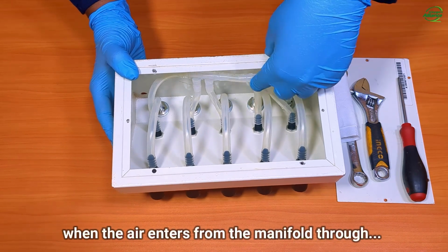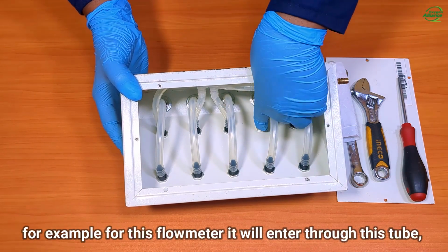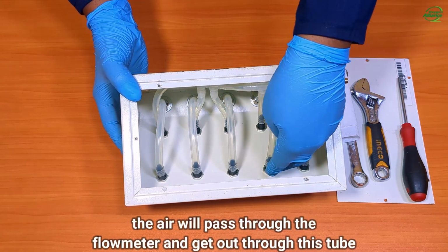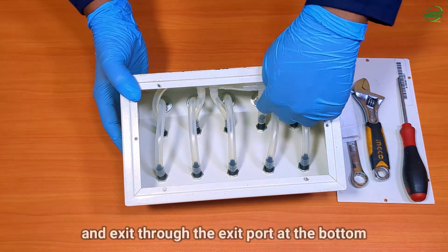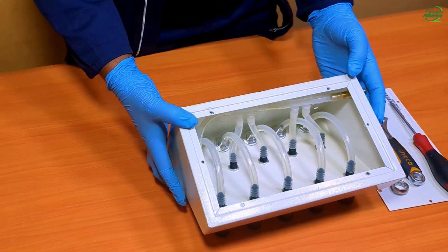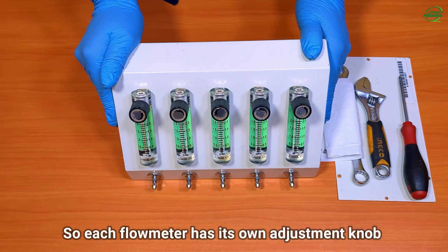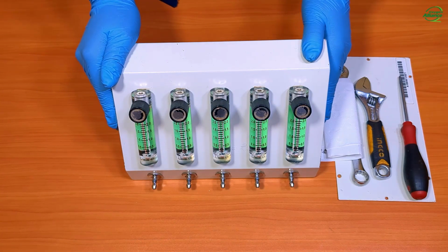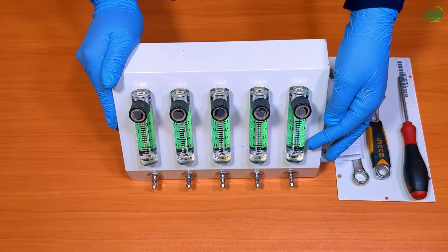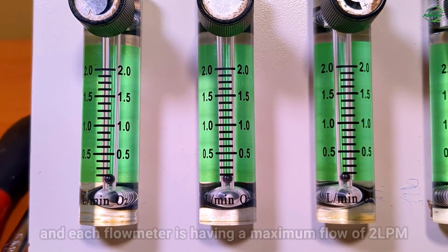When the air enters from the manifold through, for example, this flow meter, it will enter through this tube. The air will pass through the flow meter and get out through this tube and exit through the exit port at the bottom. So each flow meter has its own adjustment knob. As you can see, and as I explained, the flow meters are graduated in liters per minute, and each flow meter is having a maximum flow of 2 liters per minute.